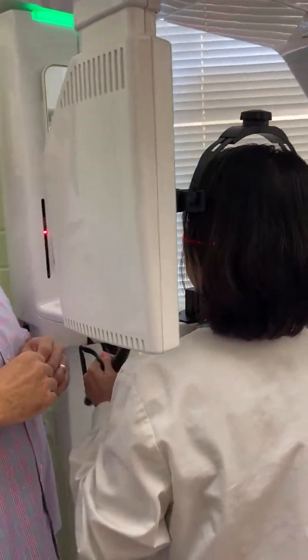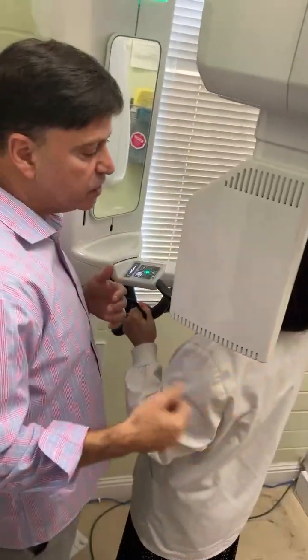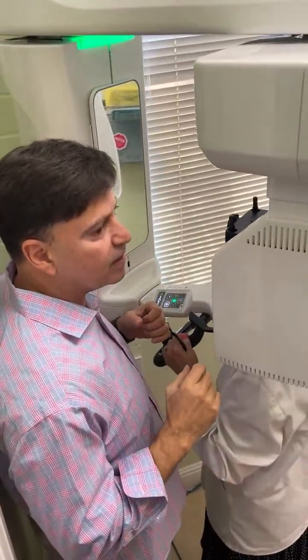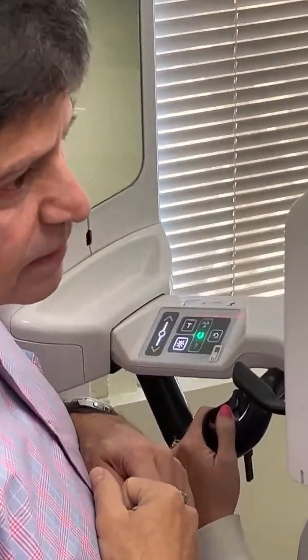Even some metal hair clips that have a spring in them. Even if they have it covered or they have a jacket, the X-ray will not go through it. The X-ray will bounce off of that. You'll get a radiopaque image, and you'll get artifacts scattered all throughout the image. And the doctor wants to look at something and says, oh, I can't see the sinus here because of this artifact.